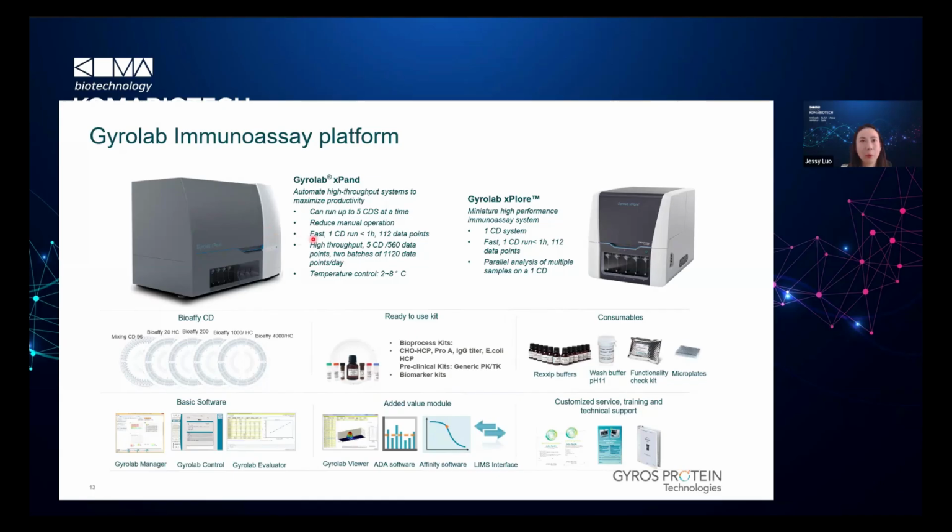That's because 1 CD gives 96 data points or 112 data points, depending on which CD you choose.